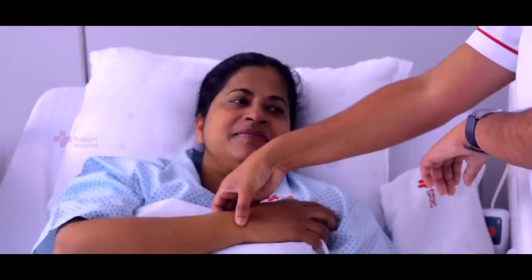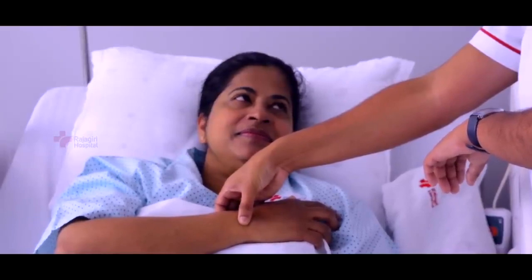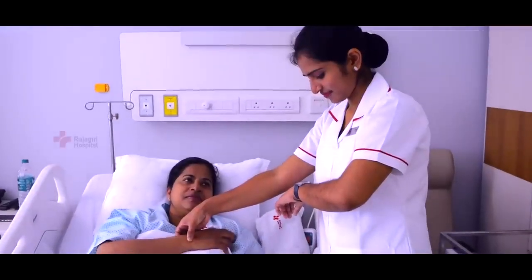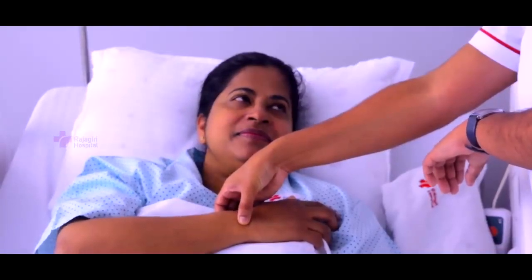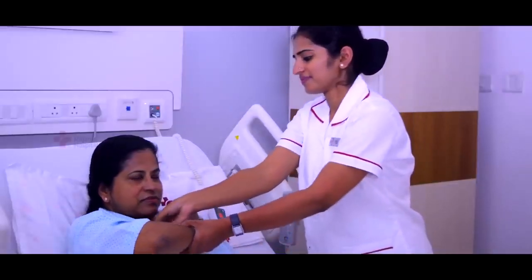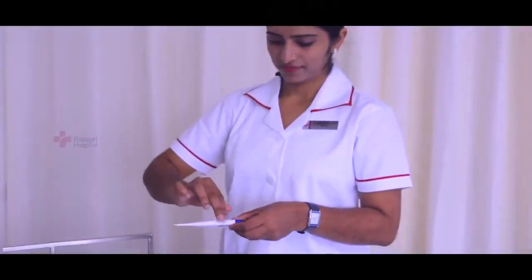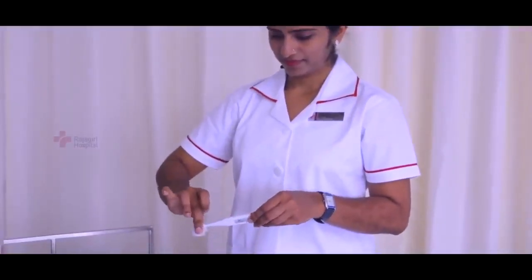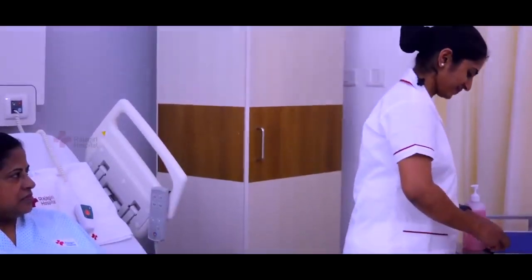Keeping the arm across the chest, observe the chest movement while supposedly taking the radial pulse. Count the respiratory rate for 1 minute and observe the depth, rhythm and pattern of respiration. Remove the thermometer once the beep sound is heard. Wipe the thermometer with alcohol swab from stem to bulb and replace it at the patient bedside.